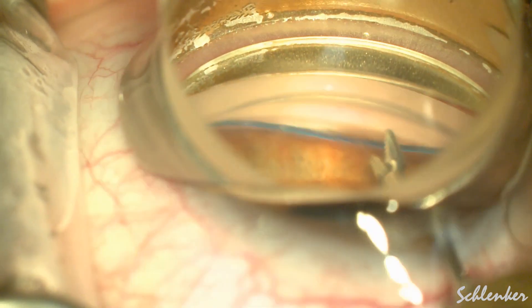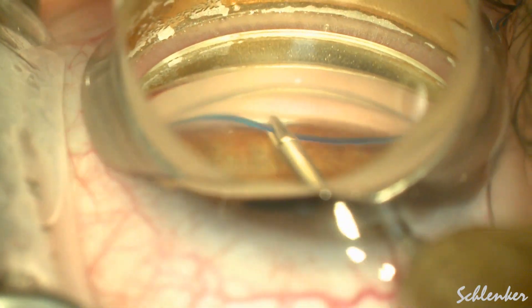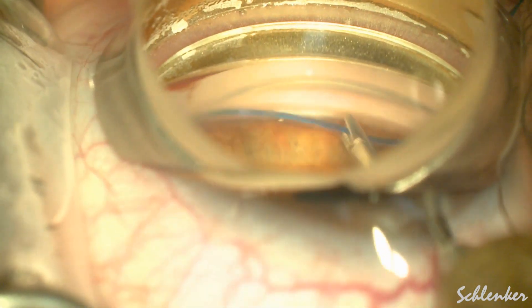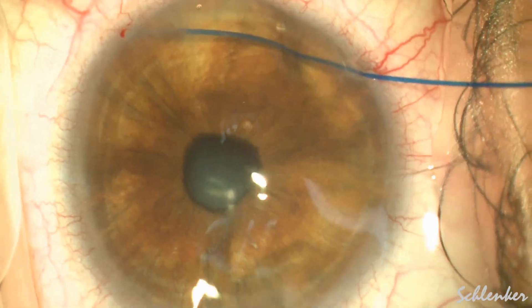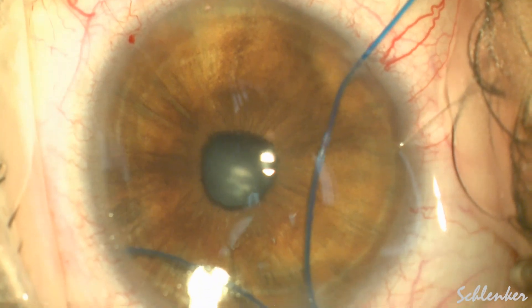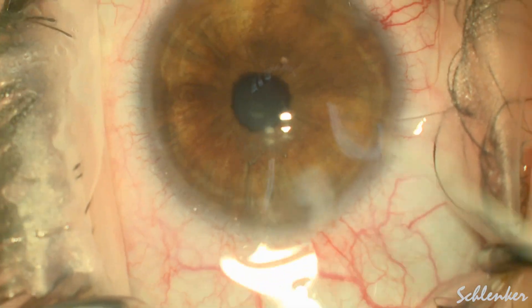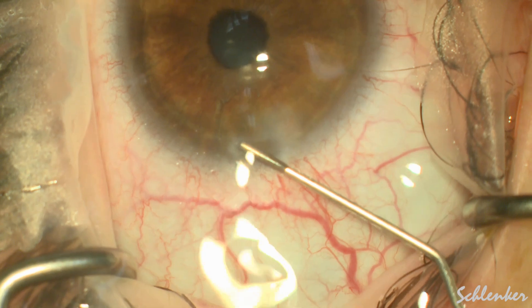Here we are feeding the 5-0 prolene. I use about 10 pushes to achieve 180 degrees. And then I sometimes — what we call 'walk the dog' — just pull that suture a little bit to make sure that it's not tracking back. It rarely does; it's a common misconception that the suture will track back. And here we are just pulling it out of the eye. Again, it did not track back, and we achieve our 180-degree trabeculotomy.